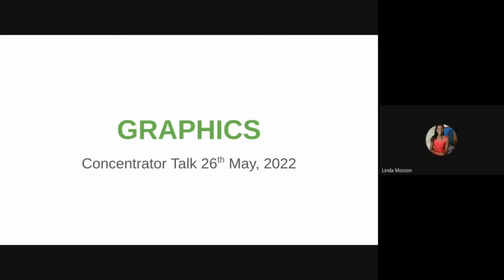Thank you, Maui. So for ASAP Intensity, be it 10 liters or 8 liters, it is equipped with an alarm system which is powered by a 9-volt battery, and the buzzer sounds continuously when there is power failure and periodically whenever there is high pressure or low oxygen purity. So whenever the buzzer is activated, there is need for an orange LED to be activated on the concentrator.